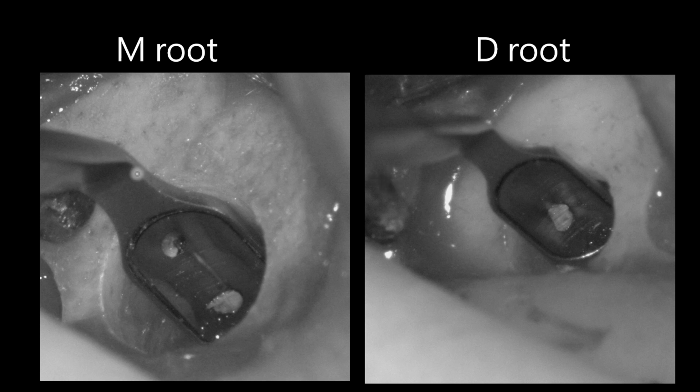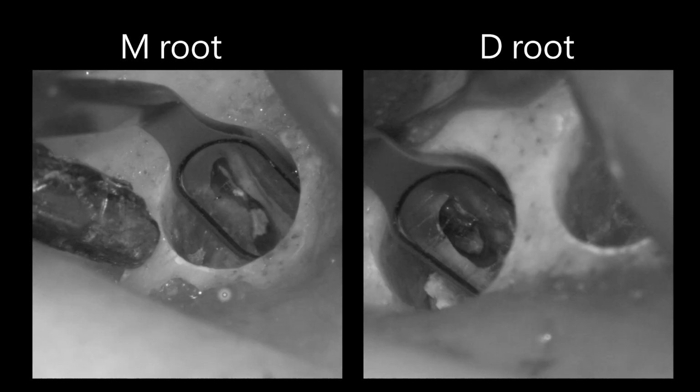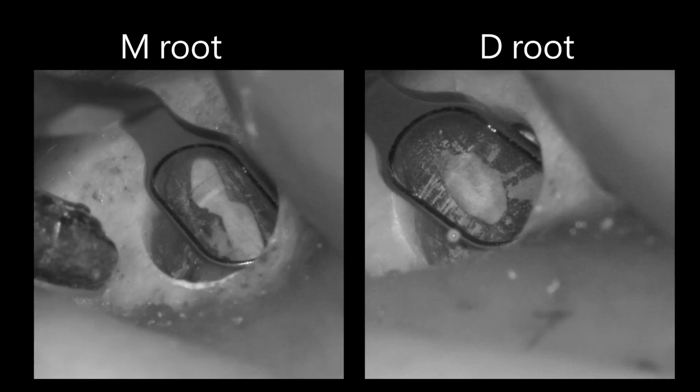And as you can see, the bone window here is a circle. It's a circle because I use the trephine. And this is the mesial root and the distal root. You can see the gutta percha inside and a little bit of distance between two canals. And this one is after I used the ultrasonic tip to prepare the root end and also open the isthmus here and also the distal canal. And this one, I also used MTA to perform the retrograde filling.